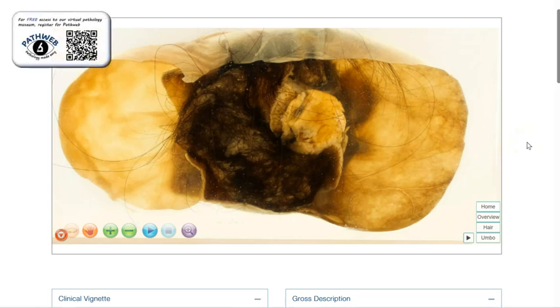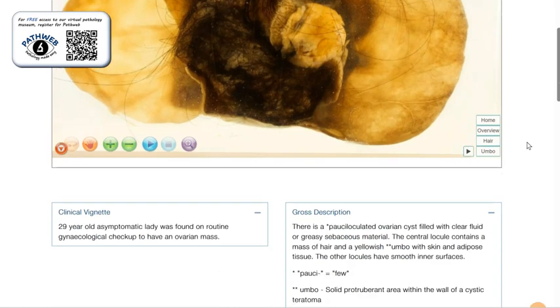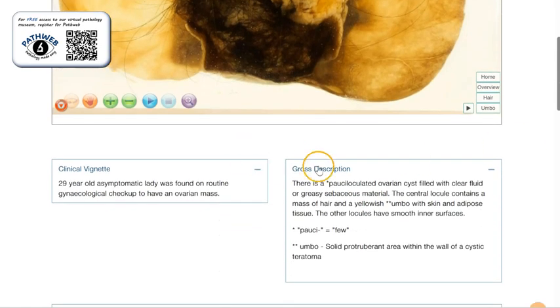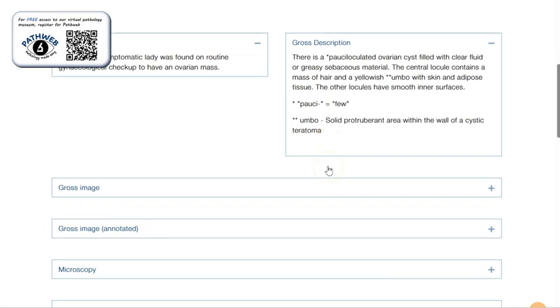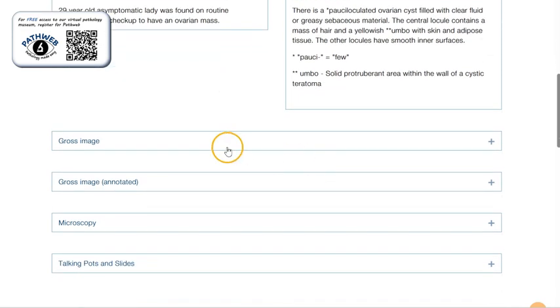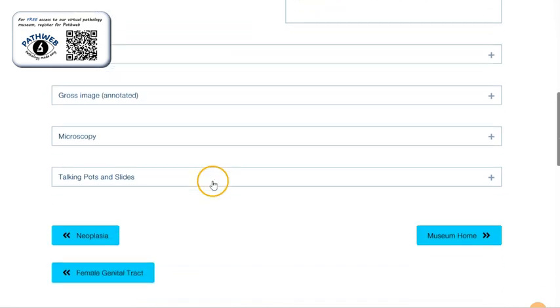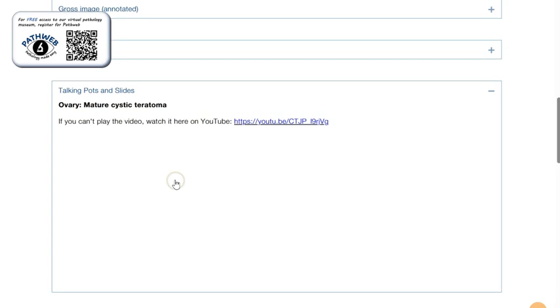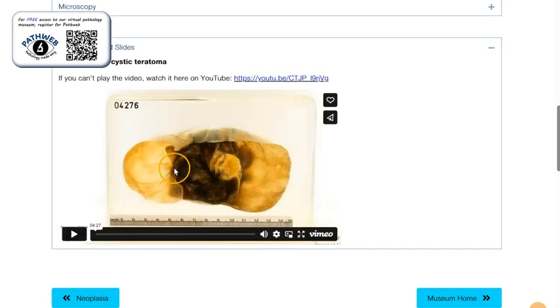This is a page taken from our virtual pathology museum in PathWeb. As you scroll down, you can see more information, as well as gross and microscopy pictures and talking points and slide videos.